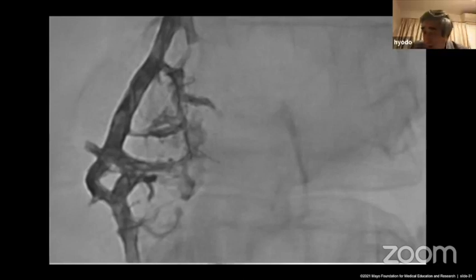I see. Okay, so what is the final diagnosis? I mean, the venography itself, or venography is just during the treatment. Yes, the venogram does not help you diagnose because the fistula is draining from the CSF into the vein. So you can't see anything in the venogram. The venogram will be normal in all the patients. So the digital subtraction myelogram is the most important thing. The myelogram is for diagnosis, the venogram is for treatment, but we are treating blind.